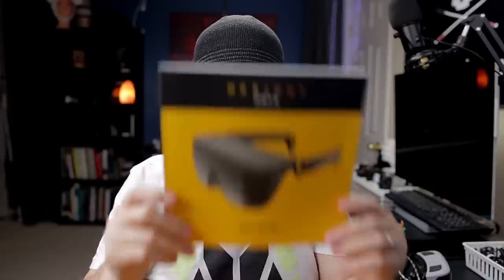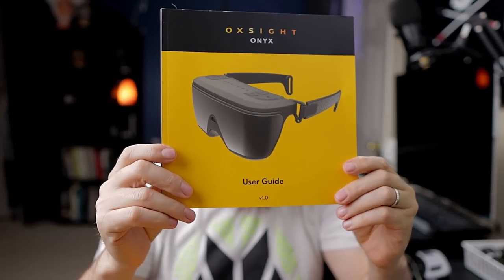Today we're looking at a brand new device on the market. Really excited to be one of the first to bring this to you guys. It's a brand new wearable — kind of. It's a bit of a hybrid between a handheld and a wearable device. Really cool, really innovative. And this is what it looks like.